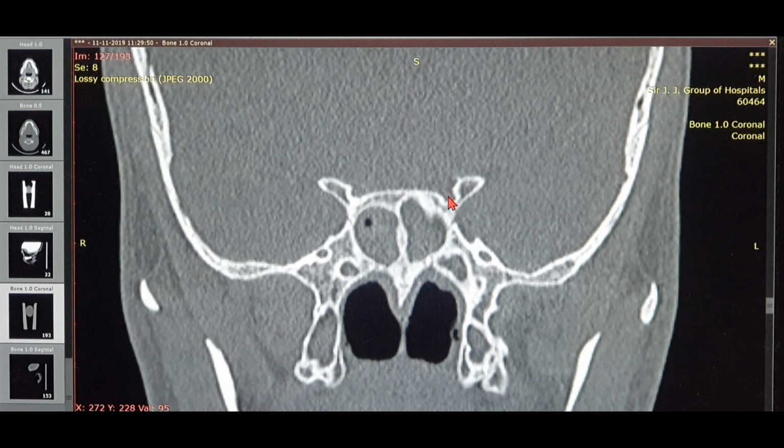So again here a question may arise, say the examiner may ask you guys to make it tougher for you, to make it a challenge for you. He may ask you what is the grading system or the classification system for the optic nerve relationship with the sphenoid sinus wall. Now your answer will be, obviously, the Delano classification. Now the spelling is Delano, D-E-L-A-N-O, Delano classification. So there are 4 grades in the Delano classification.